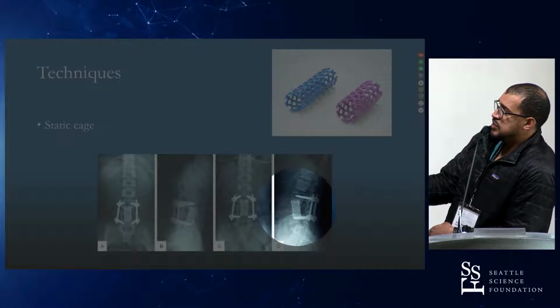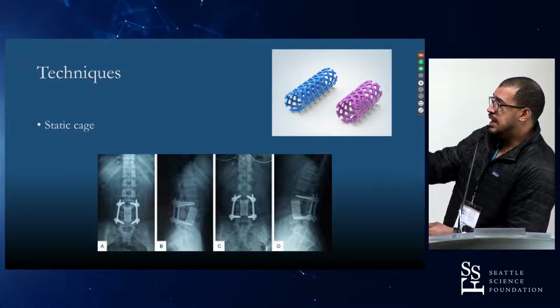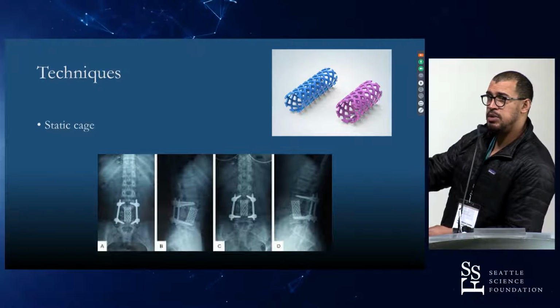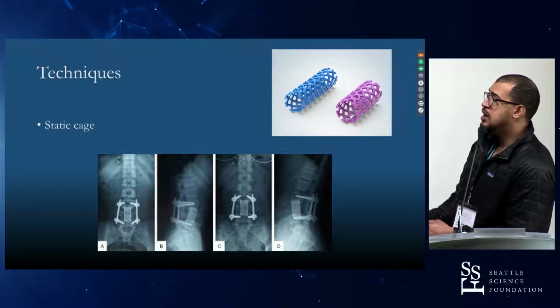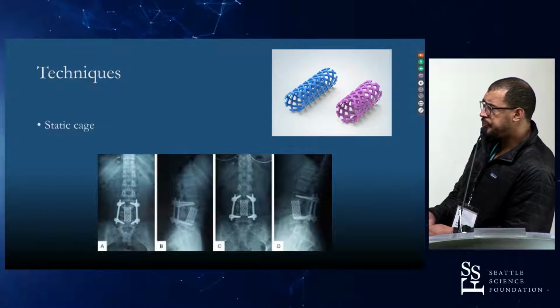very bottom of the cage to the top, and the size of the incision that you would need to use to get that full cage in there is pretty extensive. It's going to be an open type approach. You really can't use minimally invasive techniques to put this kind of cage in. This is our old standard of what we used to do to reconstruct that anterior column.